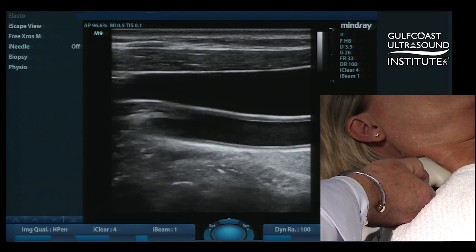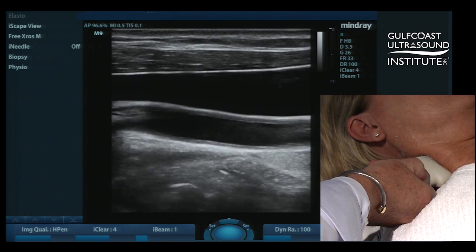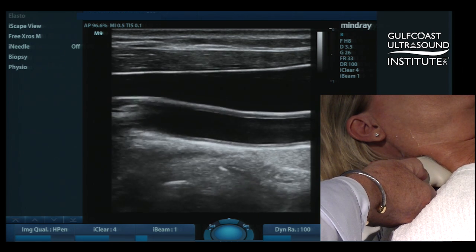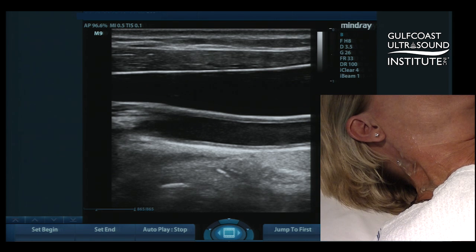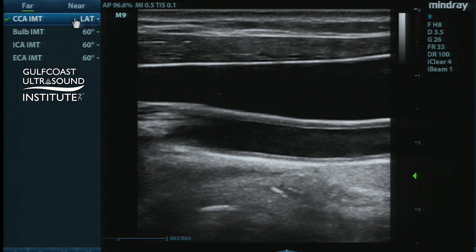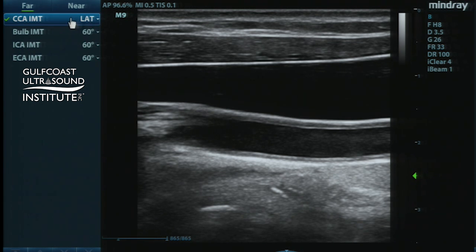And once you've acquired that image to your satisfaction, you can go ahead and simply freeze the image during diastole, at some point during the diastolic phase of the cardiac cycle. Go into your measurement mode. In this case, we're going to choose a lateral view of the common carotid artery intima-media thickness along the right far wall. So we would go ahead and select that.